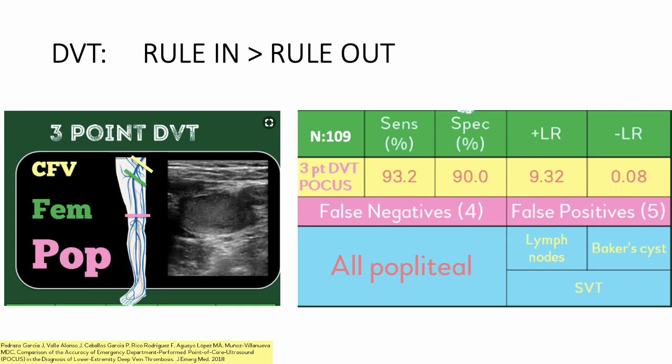But this is, again, not a complete diagnostic study. In a rush exam, this is more to be used as a quick evaluation to look and rule in DVT rather than a comprehensive study to rule it out definitively.